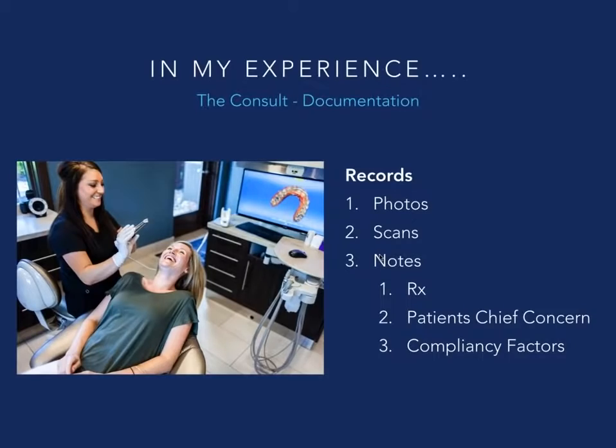If we're not really great at taking photos before, during, and even after all of our treatments, especially ones that are cosmetically and orthodontically driven, I think we're missing a great opportunity for encouraging our patients and enlightening them at the same time. Scans, I think most practices are aware of the scanning devices that are available.